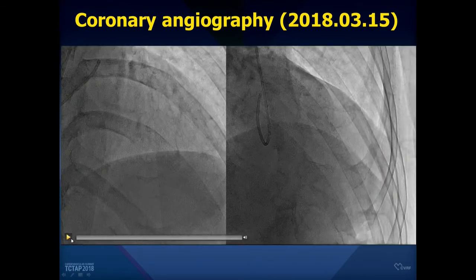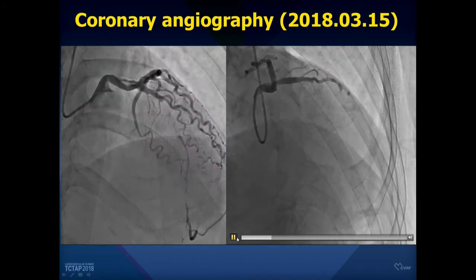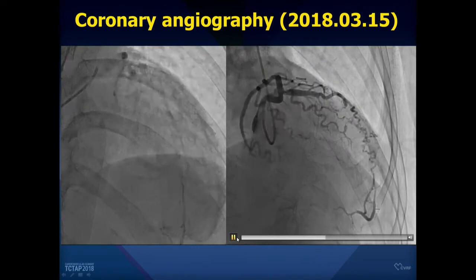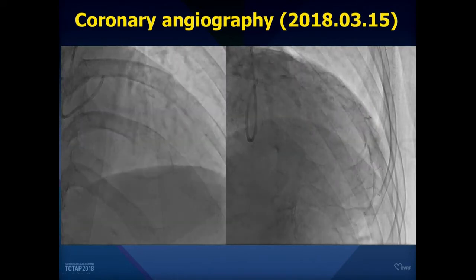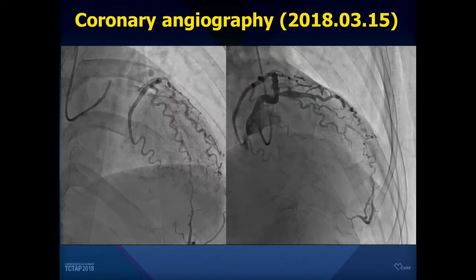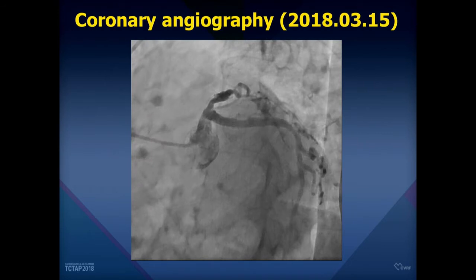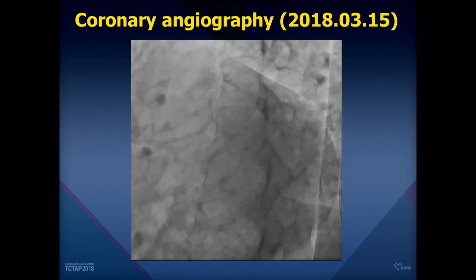Yes. The previous angio is very important. There is total occlusion of the mid-LAD. Some diagonal to distal LAD collateral flow was observed. And some lesion at the LAD ostium. Yeah, that's it. Okay.